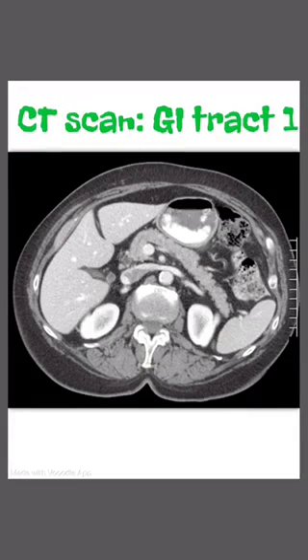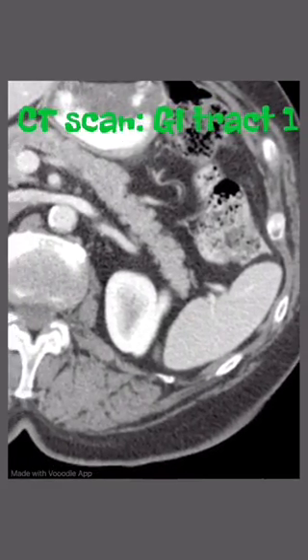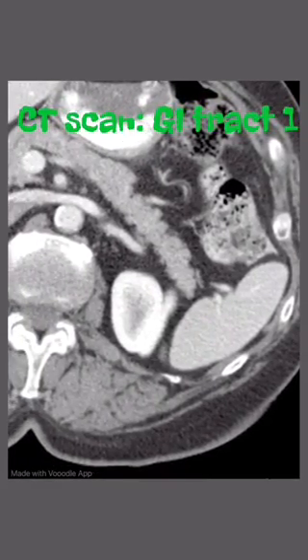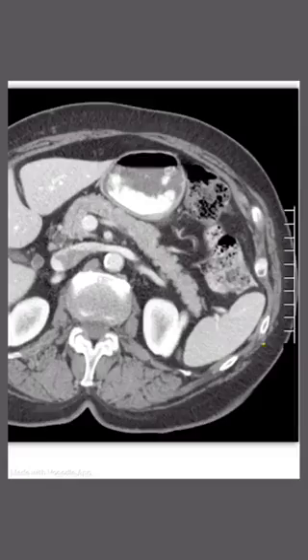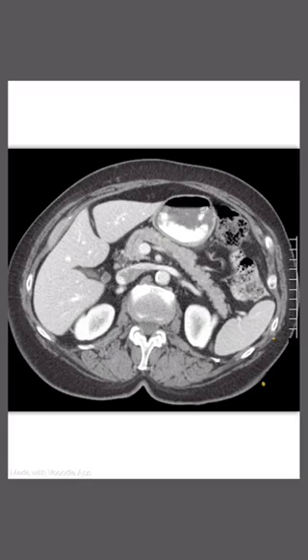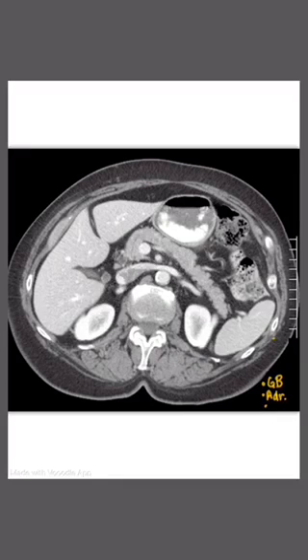Today I'm going to label a CT scan for the GI tract. What I don't have labeled — because I'm not quite sure where it's located or if it's even on the CT — is the gallbladder, the adrenal glands, and the inferior vena cava.